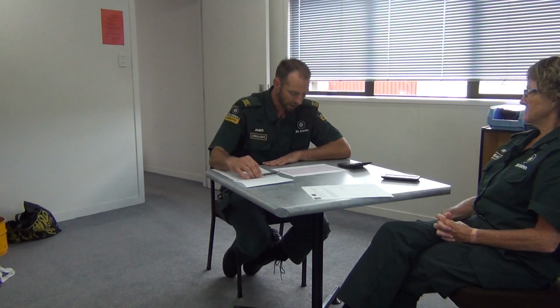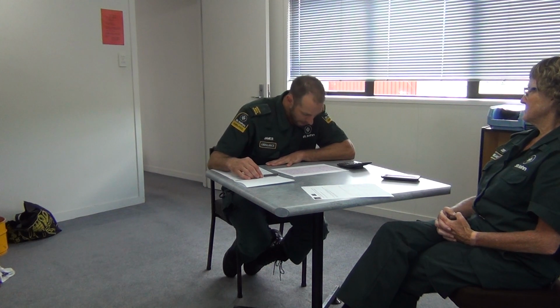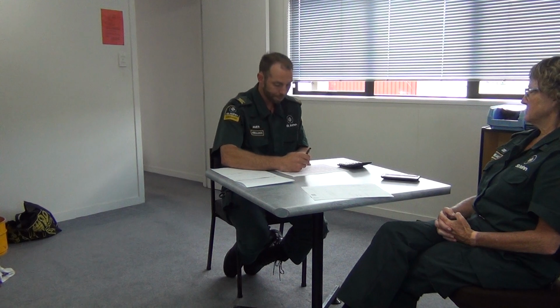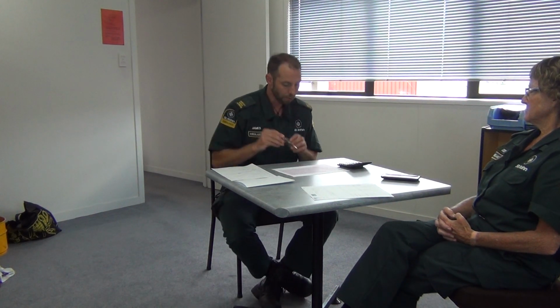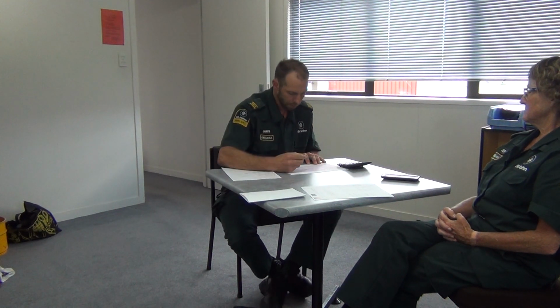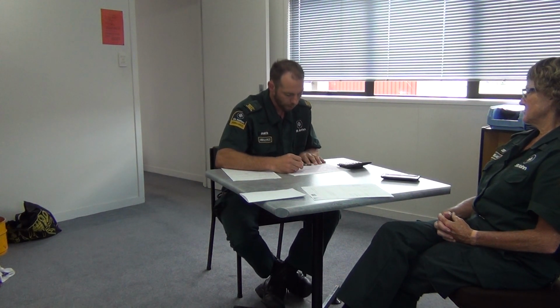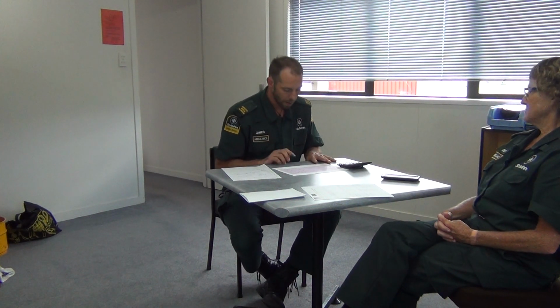Just going to look for regularity. And again, it's a regular rhythm. On this one I'm going to say that the rhythm is regular, but I can see there seems to be an ectopic beat here, which has sort of upset the underlying rhythm.